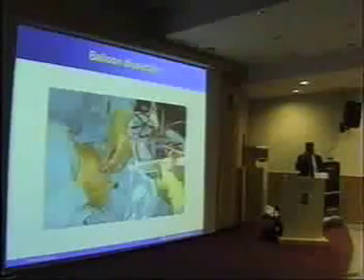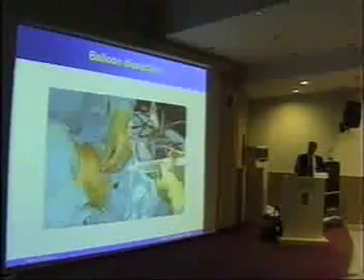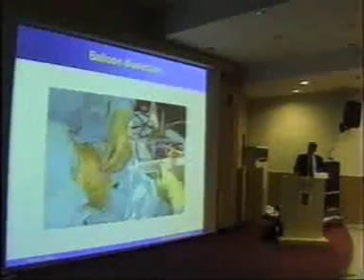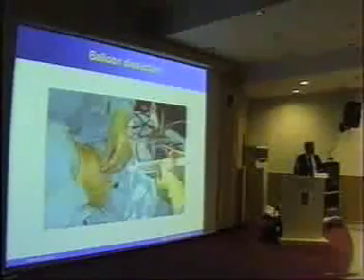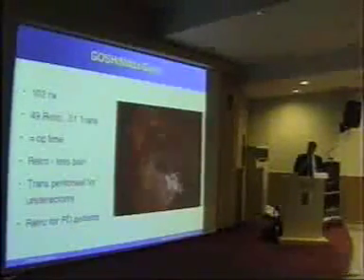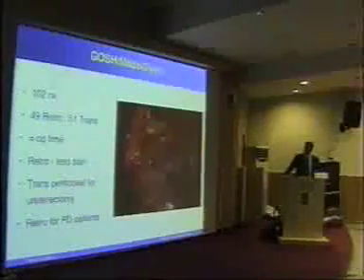Now, if you go retroperitoneally, you go from behind, and you do the dissection with a balloon, and I'll talk about nephrectomy a little bit later, because we're not going to show you the case. But you place a balloon, and we make our own balloon and inflate it with air to create the space for our first port. And these are the results from our series at Great Ormond Street in the Middlesex Hospital.